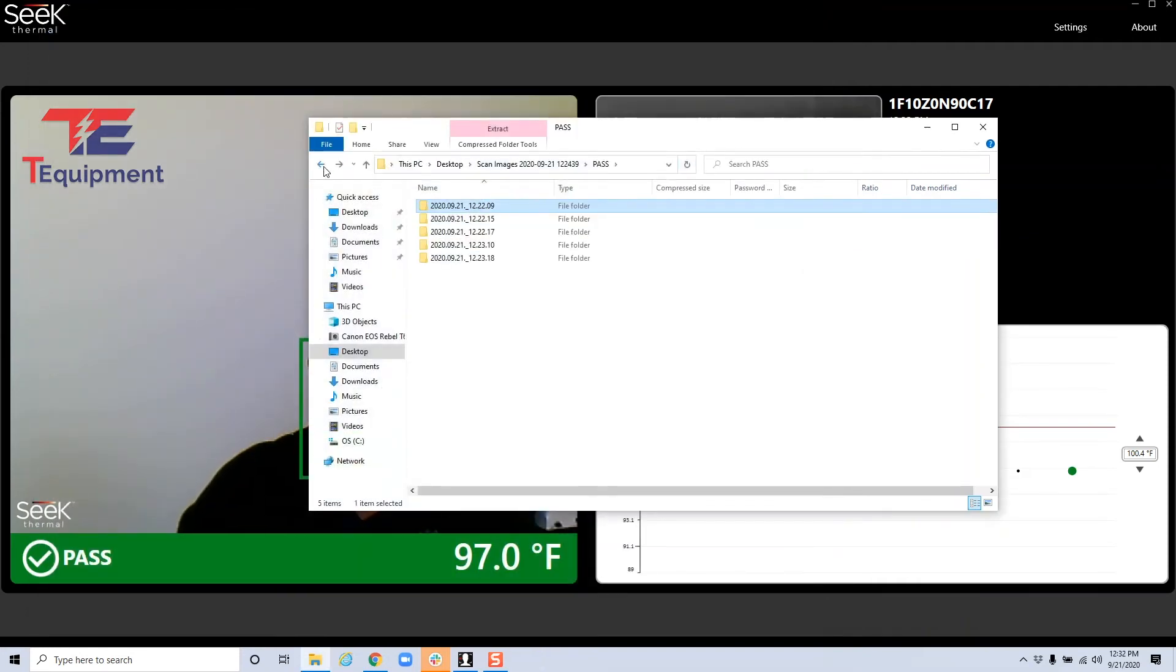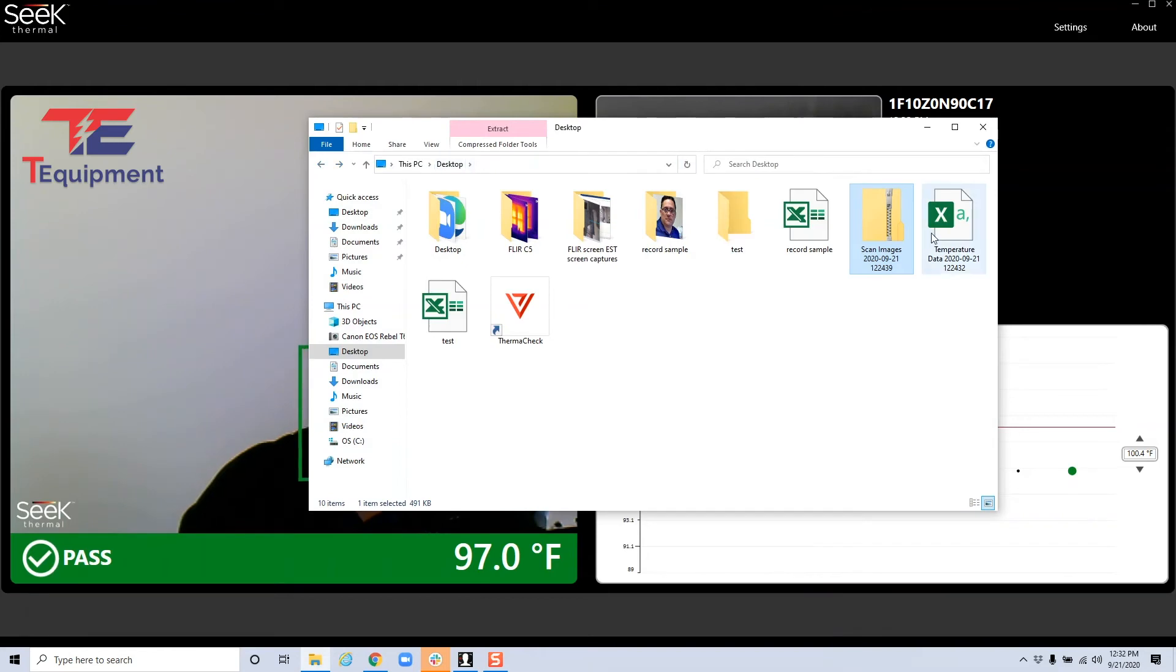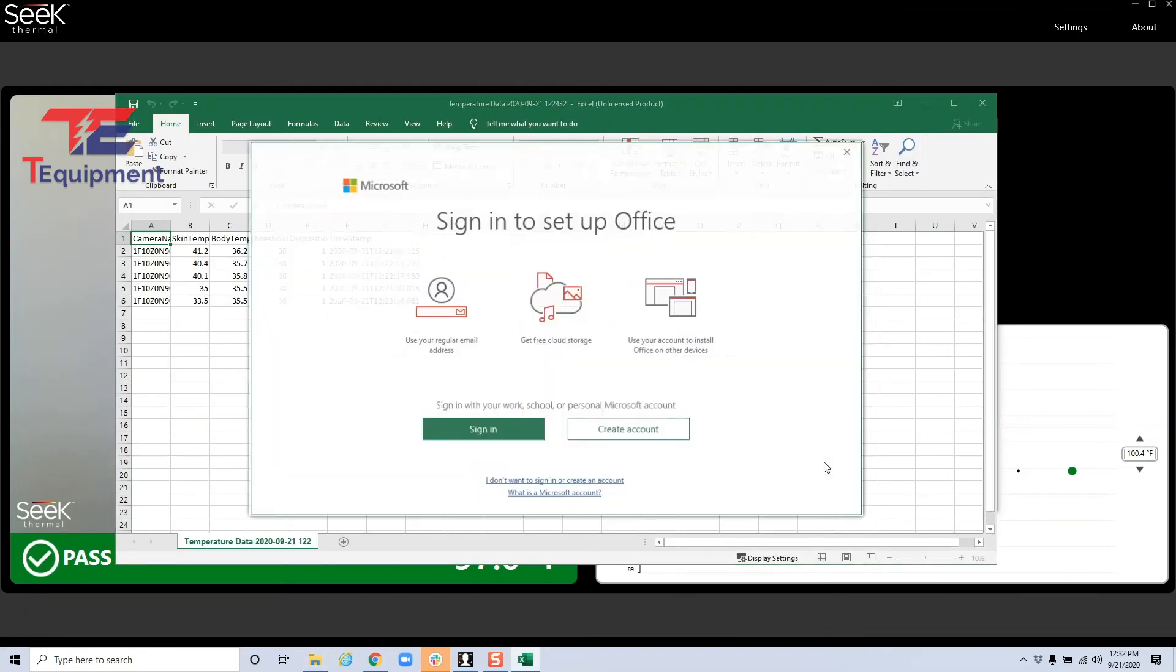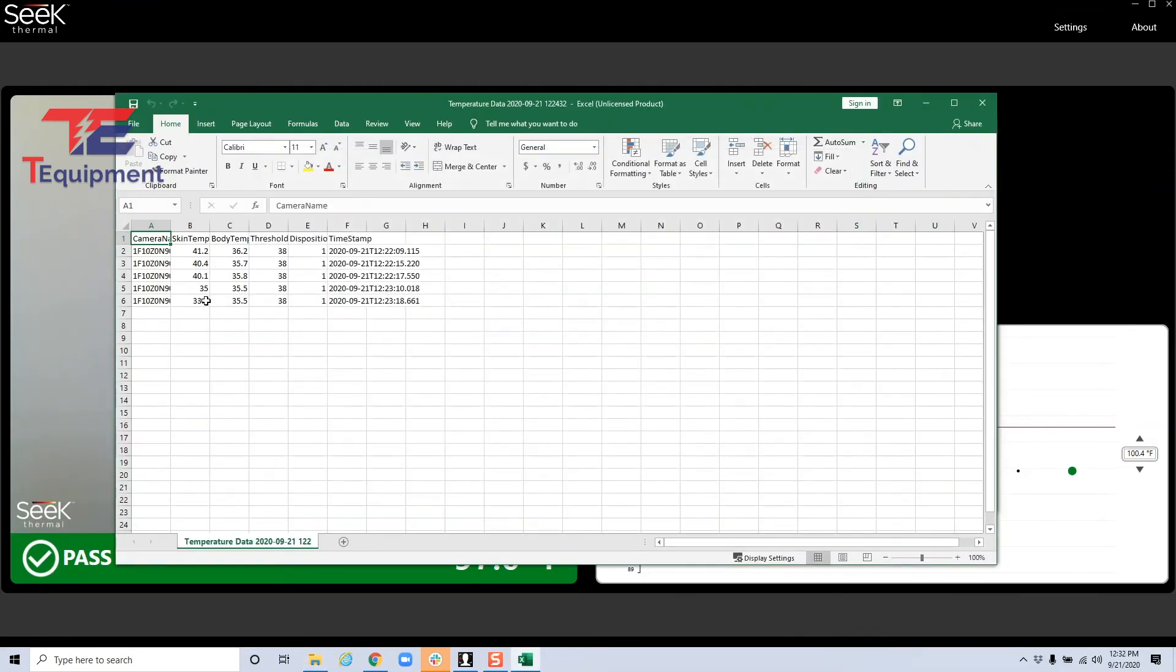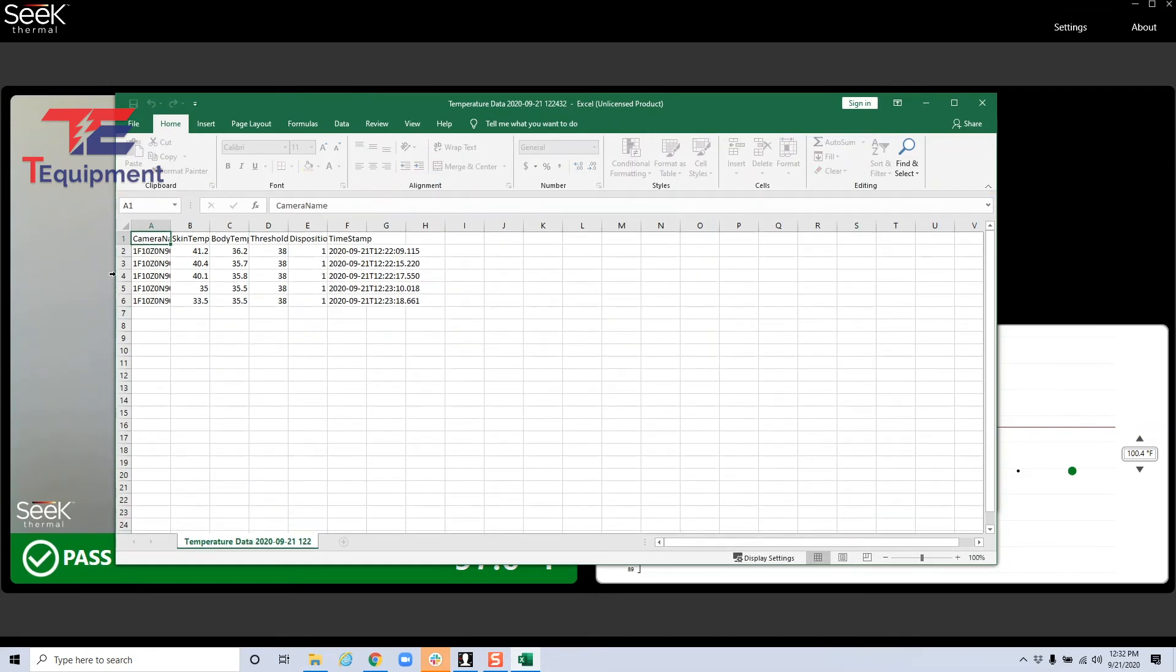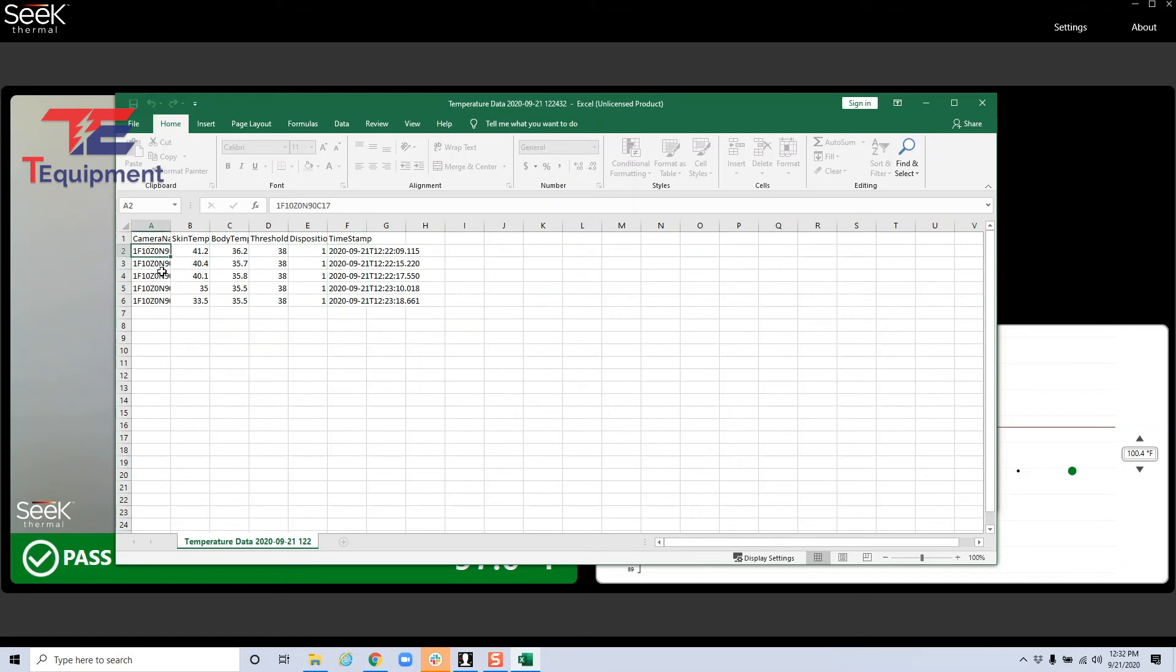Now let's go ahead and look at the data itself. And on this demo machine, we'll be able to see a couple of options here for skin temperature, body temperature, threshold, any disposition, and the timestamp as well. So again, it'll give you your camera location. If you have more than one, that could also be enabled depending on your request here.